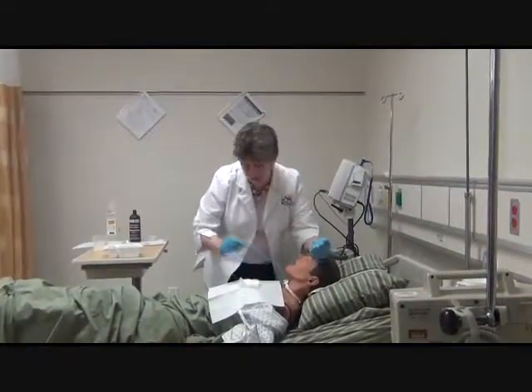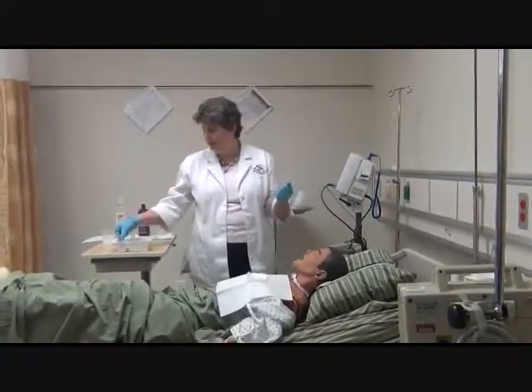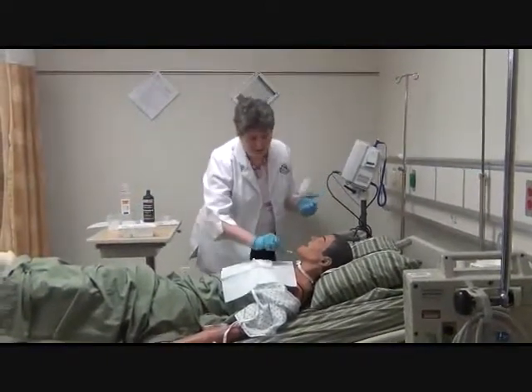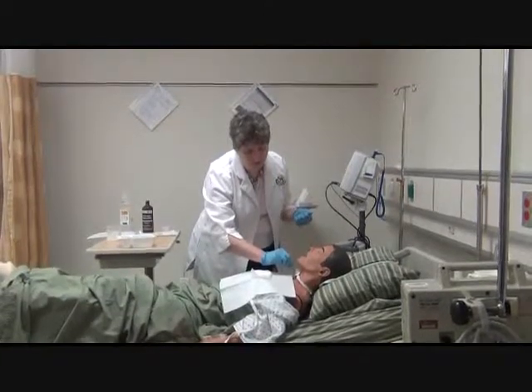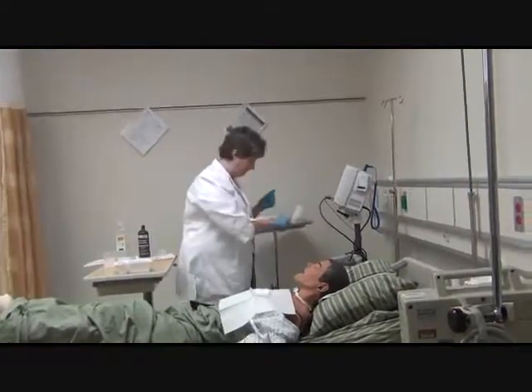I'm going to pull this out. It's going into my hydrogen peroxide solution. I'm now going to use just the saline to cleanse the area, and I'm going to start right here at the edge of the trach where I took that off, and in a circular motion.